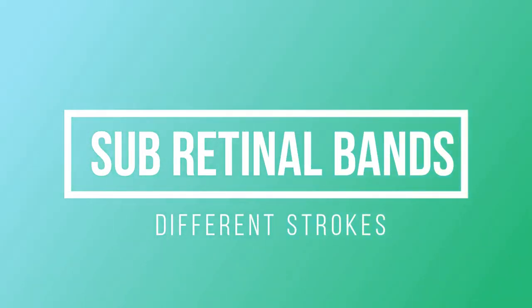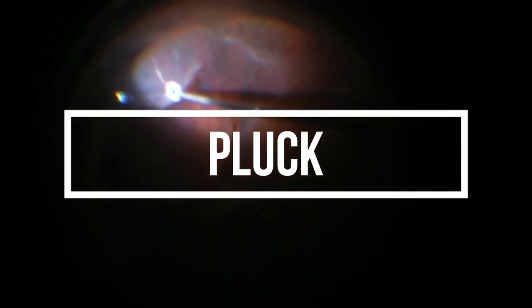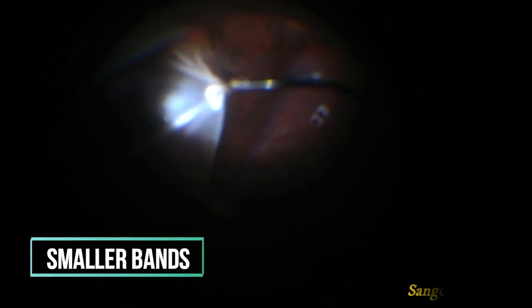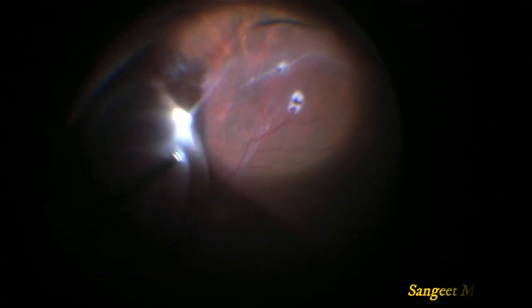This video shows different methods to remove sub-retinal bands. For smaller bands, we make a small retinotomy over the band, then grasp it with a forceps and exert a direct pull over the band.